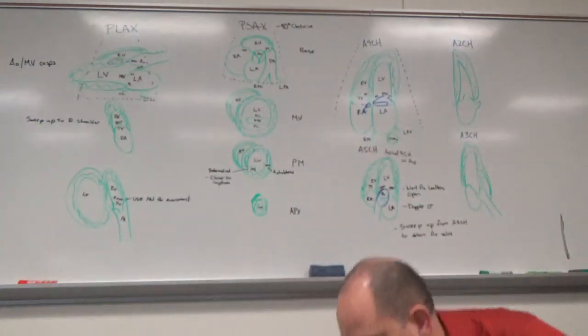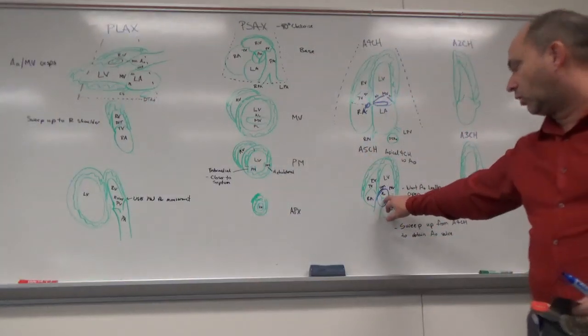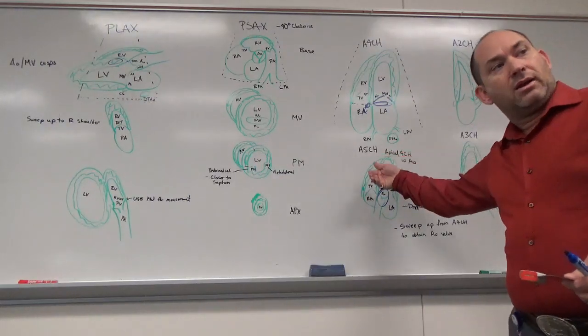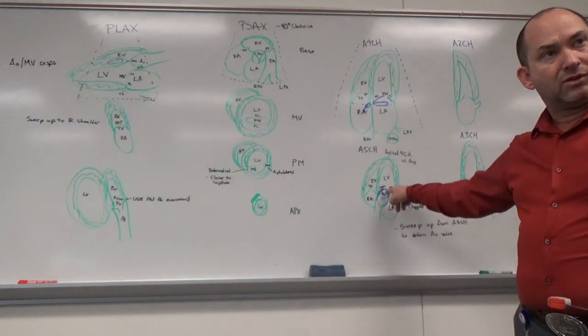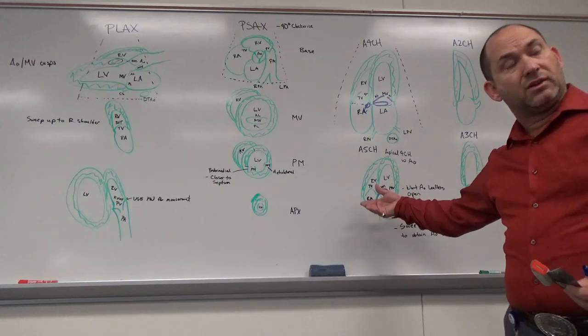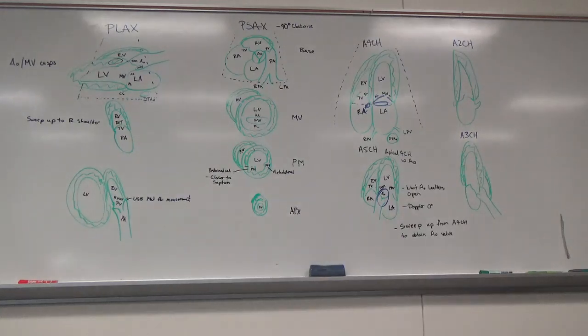That's a very common thing that people will do, and then of course if you go too far anterior, you're going to hit the aortic valve. And if I go even more anterior, the right ventricular outflow tract, what valve sits in front of the aortic valve anteriorly? Pulmonary. Pulmonary. So if you really tip anterior, you're actually going to end up in the pulmonary valve, which is really tough to get because from that perspective, it's all ribs. Okay? But some patients, you can see it.